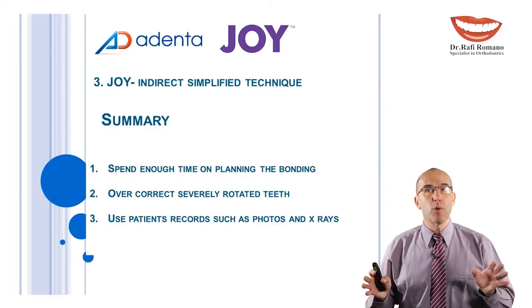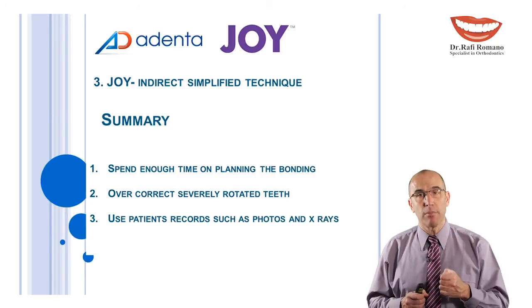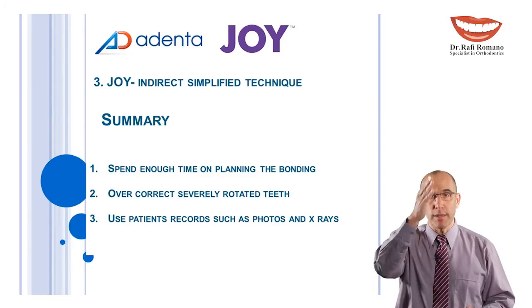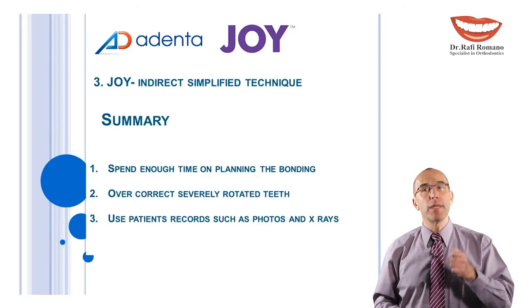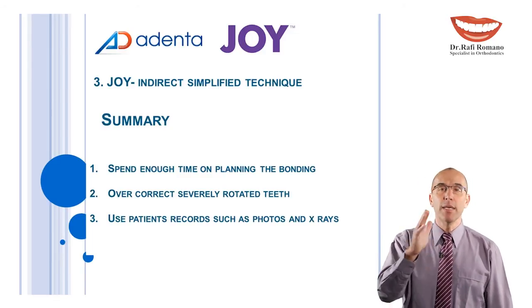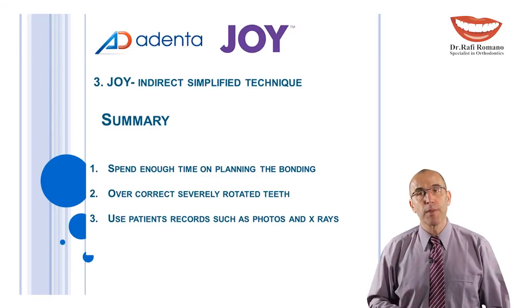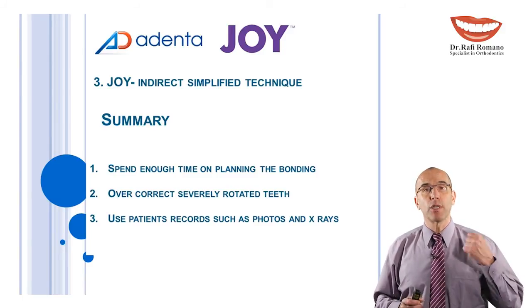In summary, what we have learned today: first of all, spend enough time on planning the position of the bracket before you touch the plaster model, and then when you take the plaster model, design the lines and place it accurately. Overcorrect severely rotated teeth. It will be easy for you to bond the bracket more mesially or more distally in a tooth you want to rotate, so it will give you a faster and more predictable rotation movement. Use patient records such as photos and x-rays in order to plan your accurate placement.